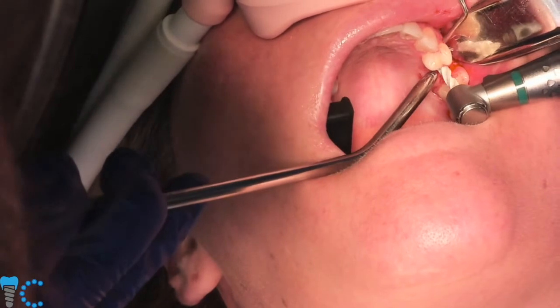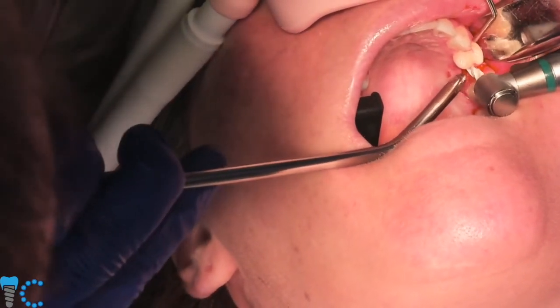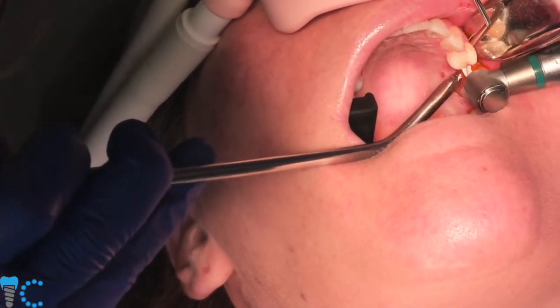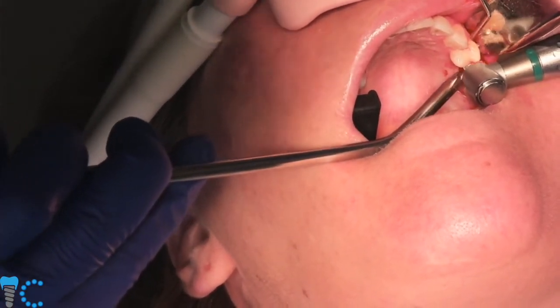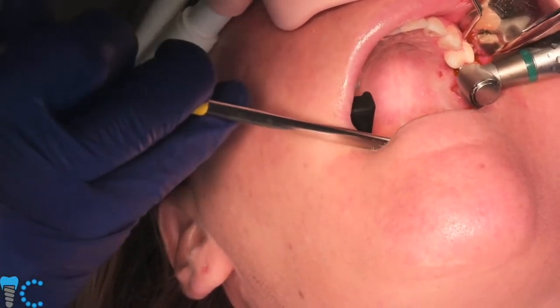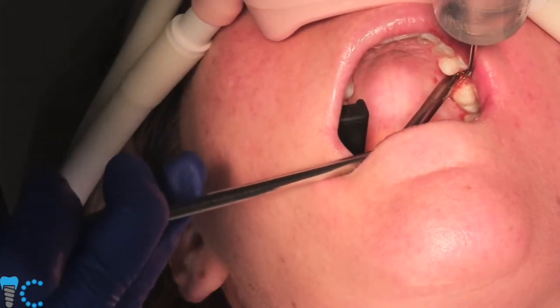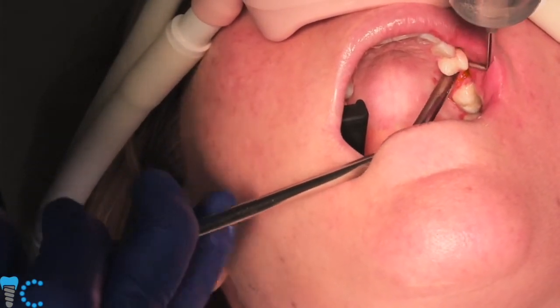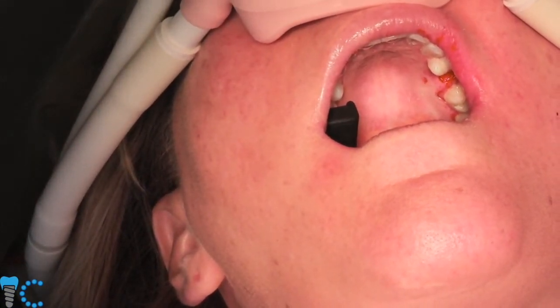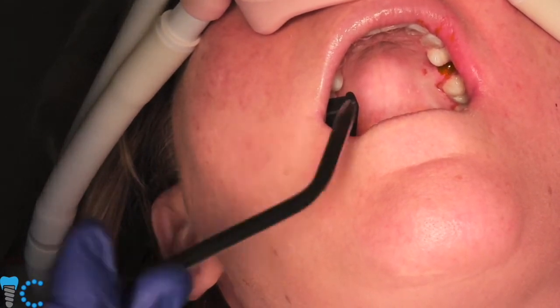Much longer. In fact, these will go and go until we eventually wear off the laser markings, the lines on them. And we've been placing zirconia implants, all zirconia implants, for 10 years. 10 years, wow. 10 years. These systems got FDA approval in October of 07, and we were one of the first 2 doctors to place them. And we've been placing them ever since.